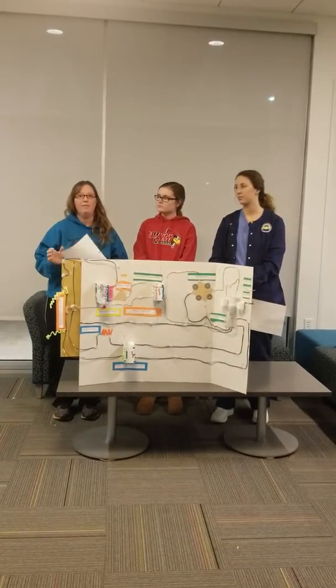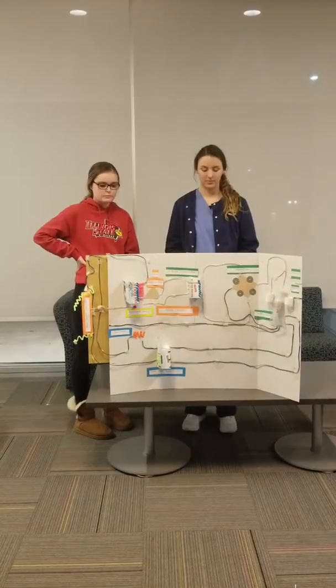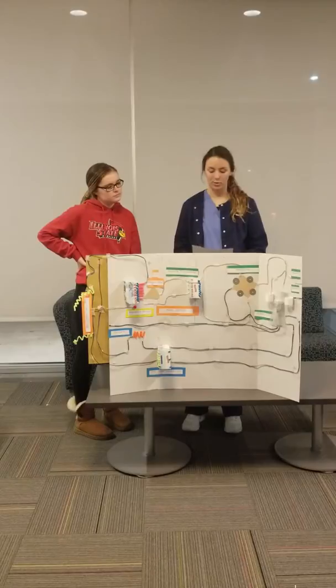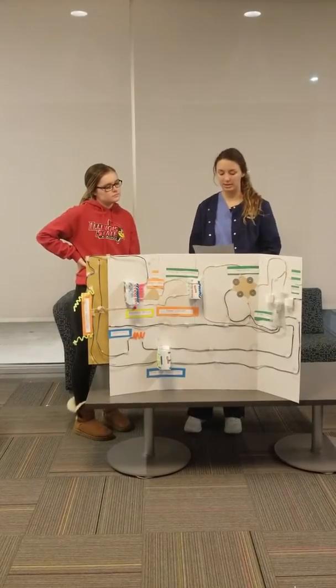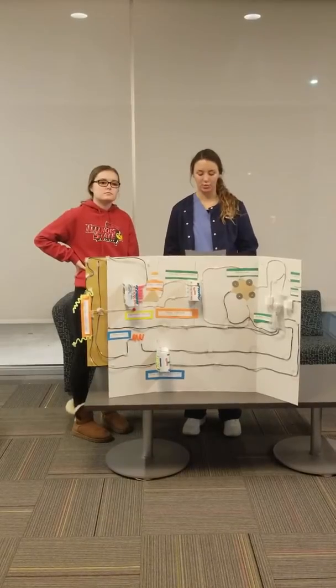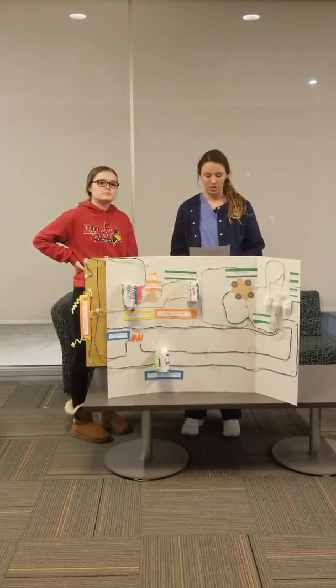And now we'll move to the filament circuit. The X-ray tube is in the secondary circuit and it is covered by a protective housing that provides solid, stable support for the tube. It also serves as an electrical insulator and thermal cushion for the tube.